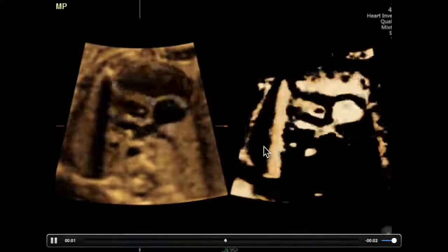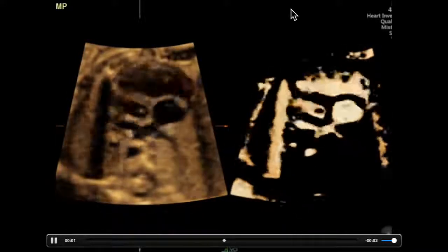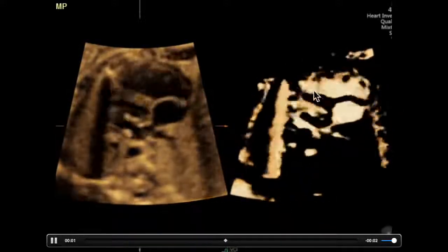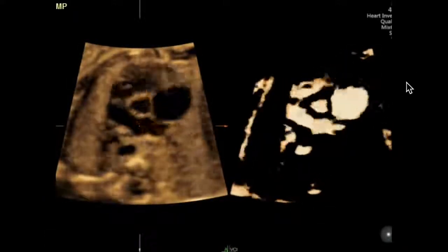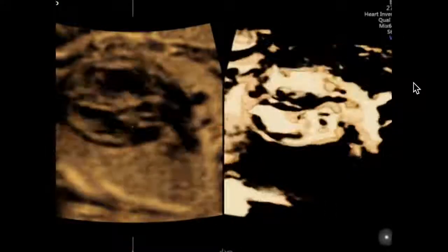If you take a short axis view of the heart and look at this area in particular, that actually corresponds to your subaortic septum, your LVOT. So the fact that we're looking at this with inversion mode really proves that there's no communication there between the aorta and the RV, or the RV outflow tract. And finally, inversion mode of a transposition.